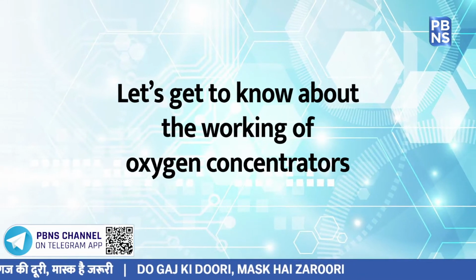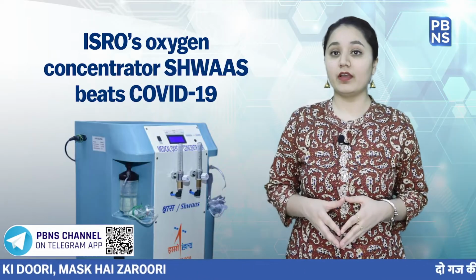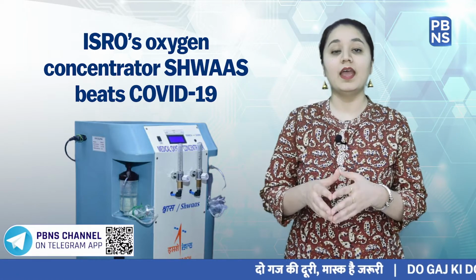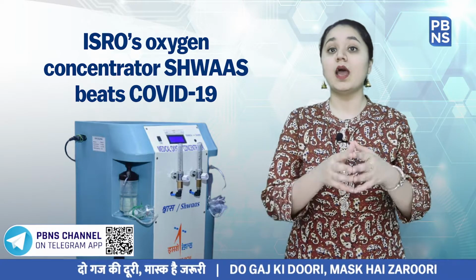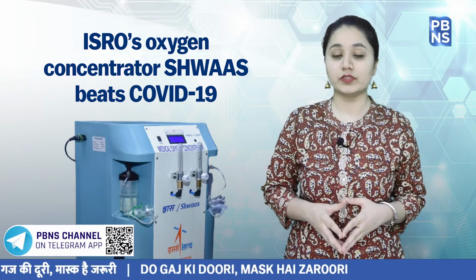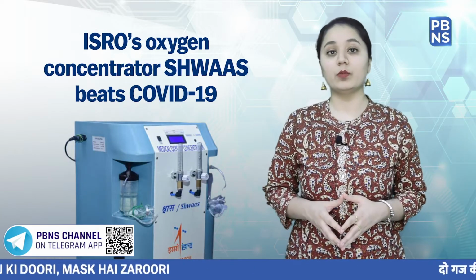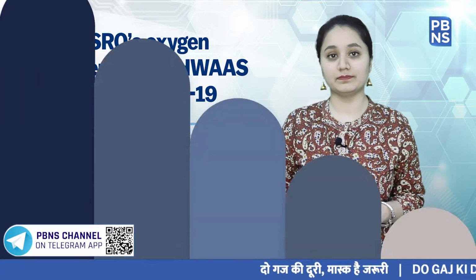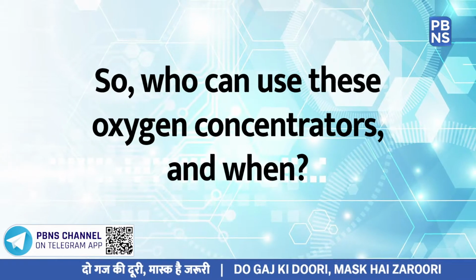Let's get to know about the working of oxygen concentrators. Atmospheric air has around 78% nitrogen and 21% oxygen, and oxygen concentrators help in increasing the oxygen concentration by filtering out the nitrogen present in the atmosphere. Oxygen concentrators can work 24/7 and there is no need to refill them. So, who can use these oxygen concentrators and when?